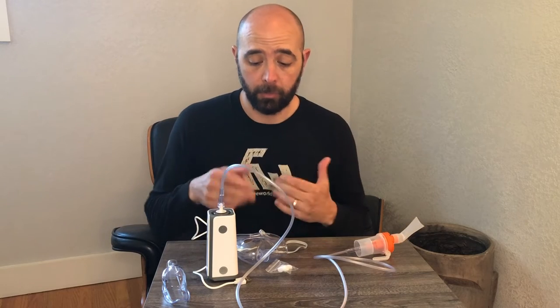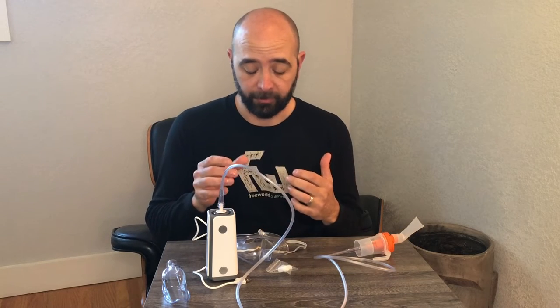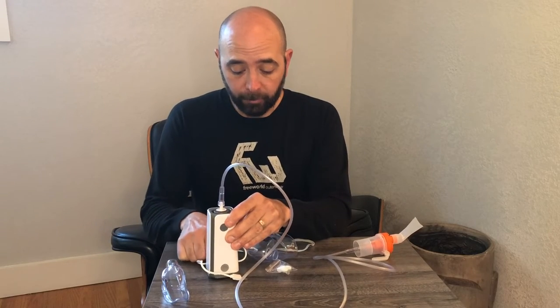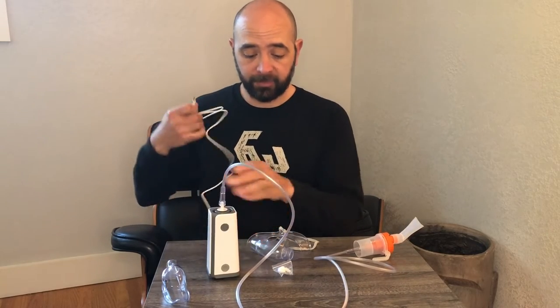I just got a new nebulizer and this one's really great for a couple of different reasons. It comes with a lot of different attachments depending on the type of medication that you would use.